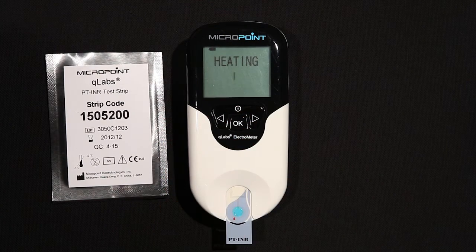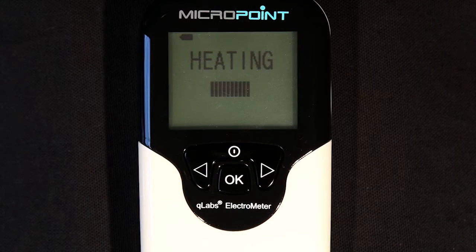After confirming the code, the Q-Labs Electrometer will automatically heat up for the test. When ready for sample testing, the unit will beep and prompt the user to apply a blood sample.